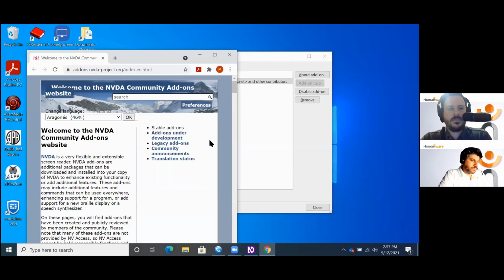Welcome to the NVDA Community Add-ons website. All right, here's the Community Add-ons website, and this has a ton. There are tons and tons of add-ons for NVDA. You can really get into some neat stuff here and really spend a lot of time. What I want to do, though, is find the Braille Extender.